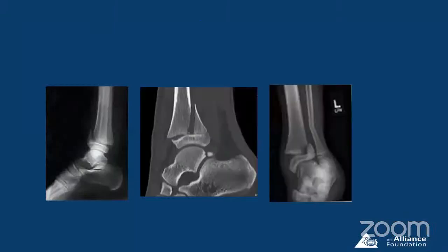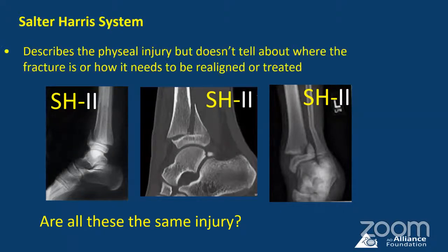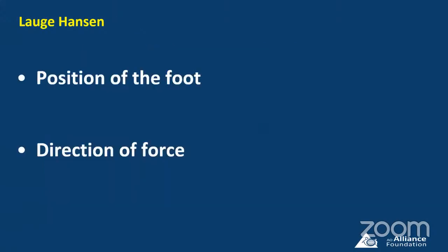Okay, so there are various fractures which may be seen. This is Salter 2. If you see the Salter Harris classification, all of them are Salter 2. This is a Salter 2 with a metaphyseal fragment. This is a Salter 2, but here it is anterior. Here this is posterior. Here this is lateral. So Salter Harris 2 does not describe the mechanism of injury. For the ankle fractures, it is not enough to know the Salter Harris classification. The Salter Harris is always an adjunct, but it doesn't tell you how it needs to be realigned or treated.